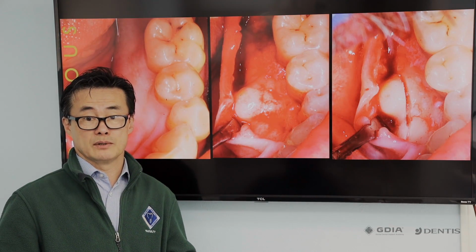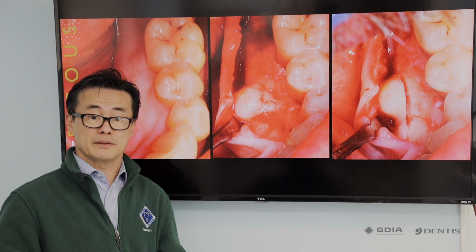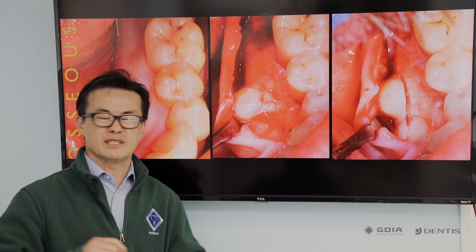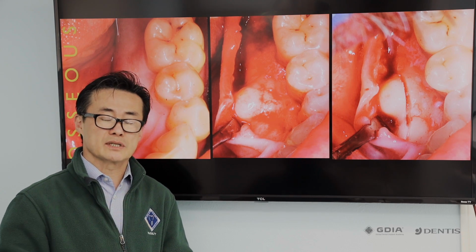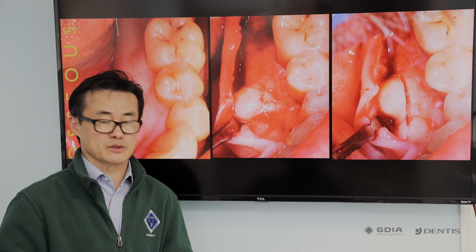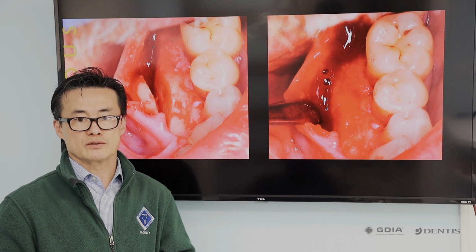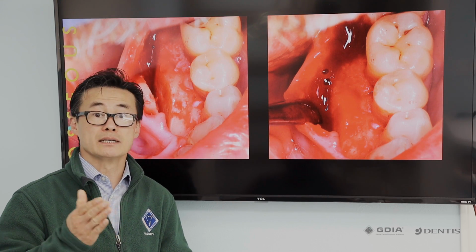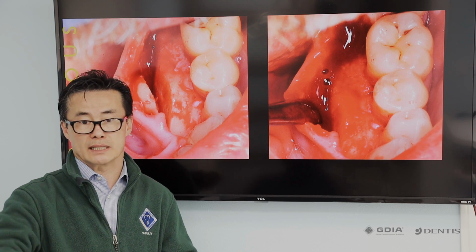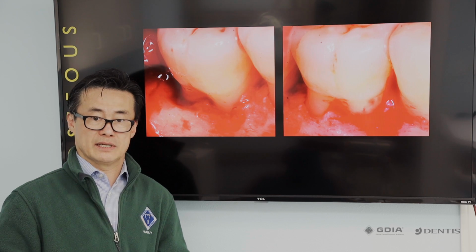This is a good example. Mandibular tori, palatal tori, sometimes even in the buccal area, we see tori that needs to be taken away. Rotary burrs in very restricted areas such as the lingual floor of the mouth could be dangerous because the burr can wrap into the tissue and cause more trauma. So saw tips or certain types of particular tips that can go into tight space and reduce the bone and get out of there is a very, very efficient way of using this device.